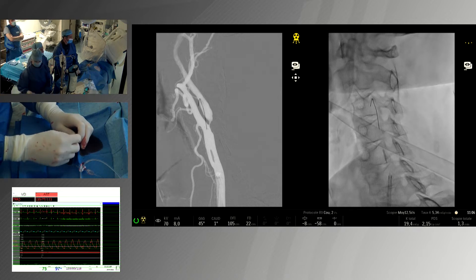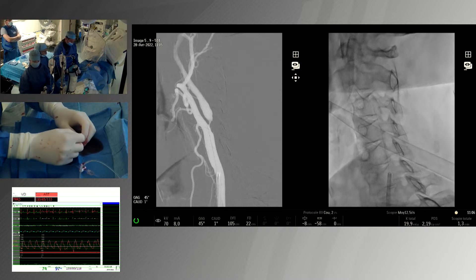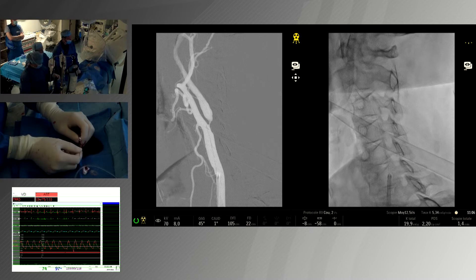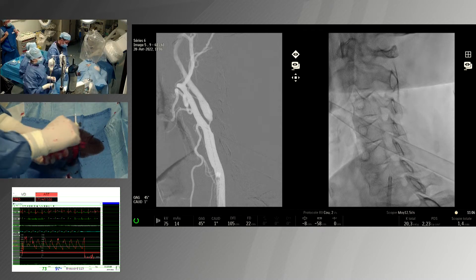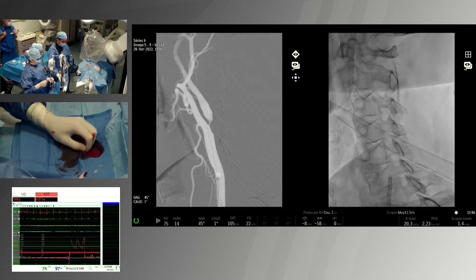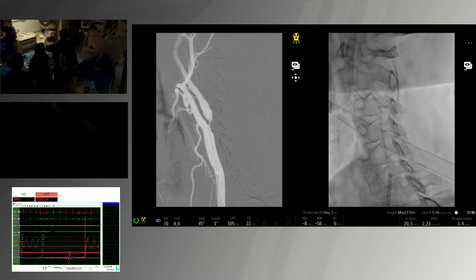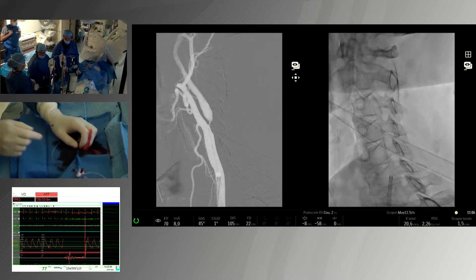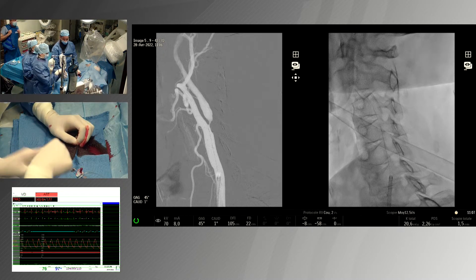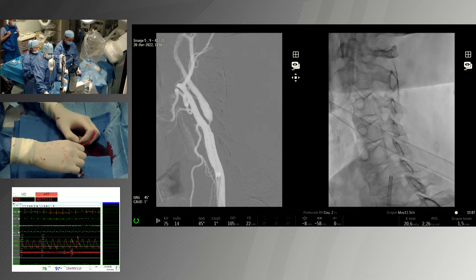You may have some difficulties crossing because the stenosis is very severe, but it went very well. We are going to pre-dilate with a four millimeter balloon. The filter has been placed above the lesion and the deployment of the filter is easy. We have prepared a four millimeter by 20 millimeter balloon, well prepared to avoid any embolization.